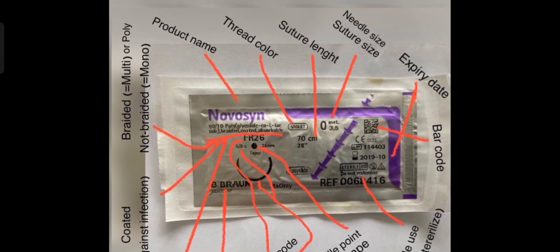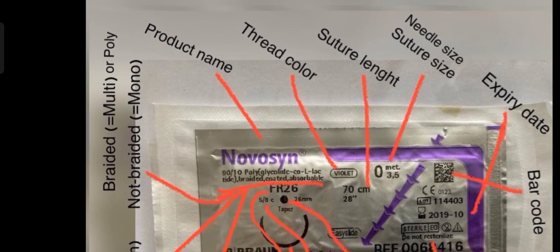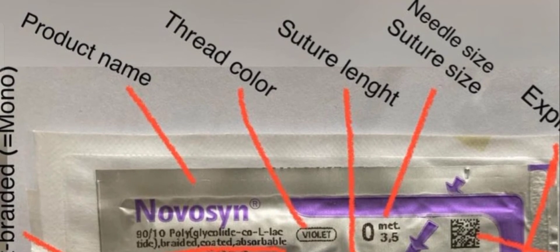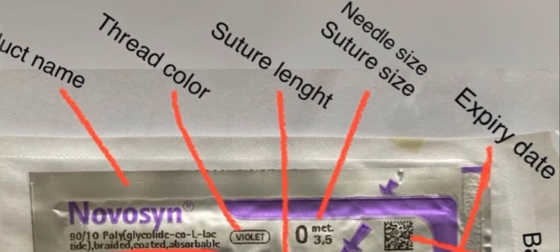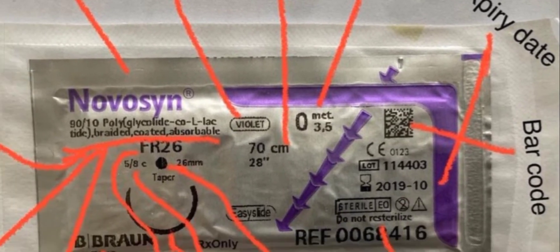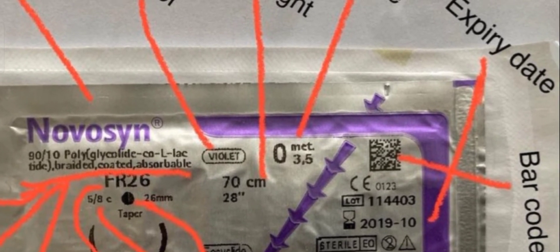When you have the suture packet, you must read all the details on it. I have marked all these things. First, it's the Novosin — that's the product name. Then in violet, it's basically the thread color. Then in centimeters, the suture length is written, and the needle size or suture size is also written there where I am marking.